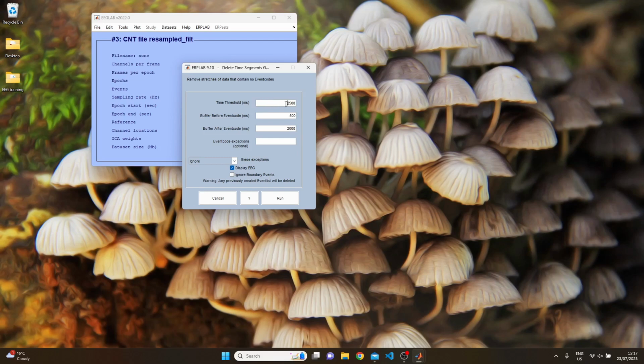The time threshold is the minimum period of time with no triggers that will prompt EEGLAB to delete a data segment. Imagine you have a study where people see a prime and a target and then respond. You want to ensure that the time threshold is longer than the interstimulus interval between the prime and the target and the response period. On top of this, you need to make sure it's longer than the intertrial interval, so the point between the participant responding and the next trial beginning. For the present dataset, I know that our interstimulus interval, response time and intertrial interval are shorter than 1,500 milliseconds, so I'll set this as the time threshold.